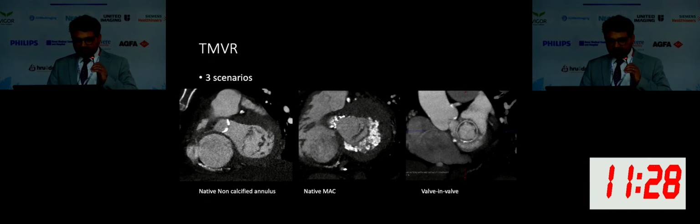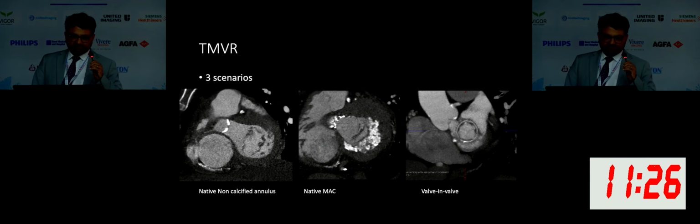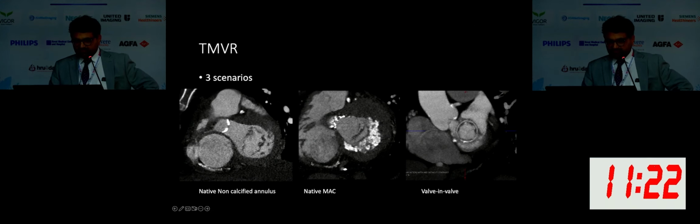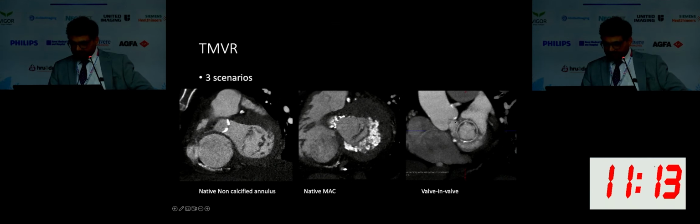So as I said, there are three scenarios where TMVR is done. One is native valve non-calcified annulus, which is the most common. Then we have valve in MAC, where there is a large mitral annular calcification. And then there is a valve in valve, where we are placing a device inside a bioprosthesis.